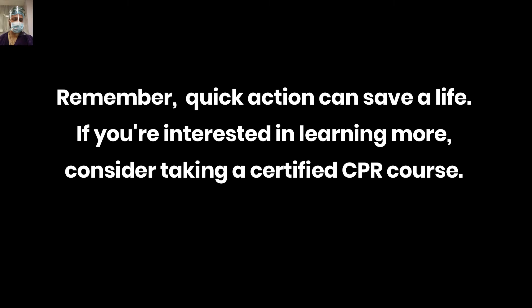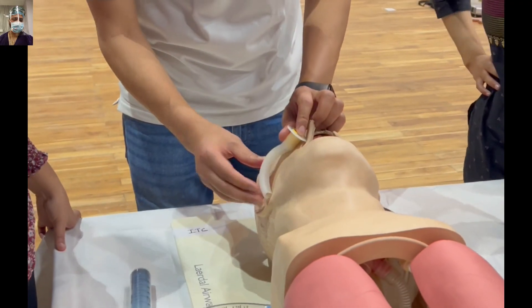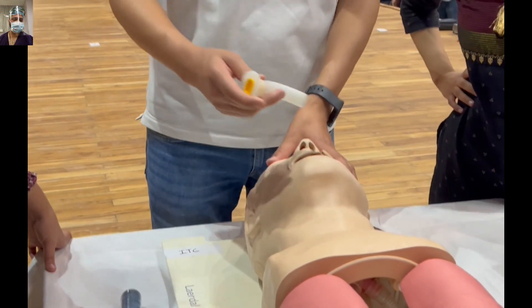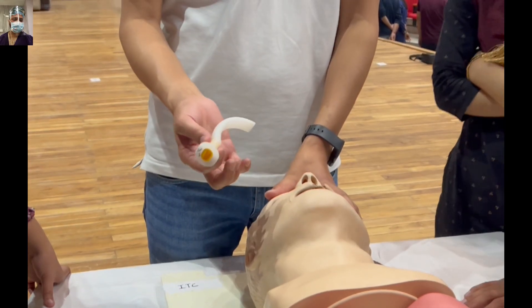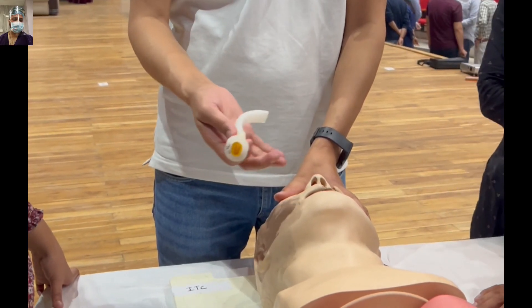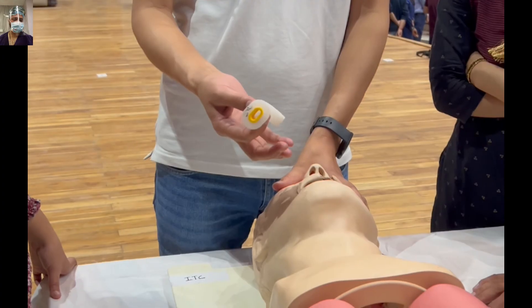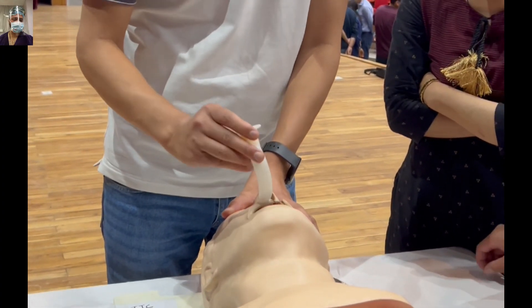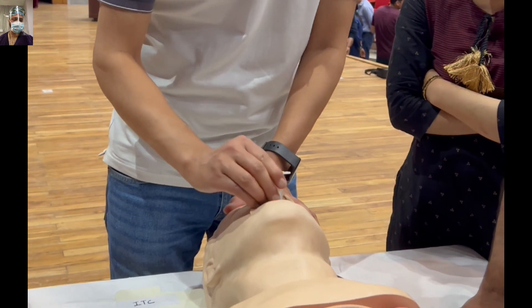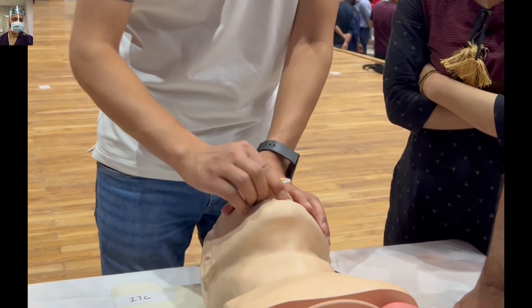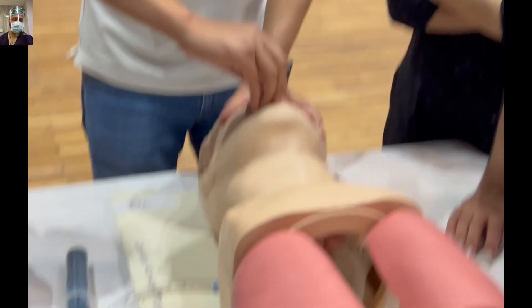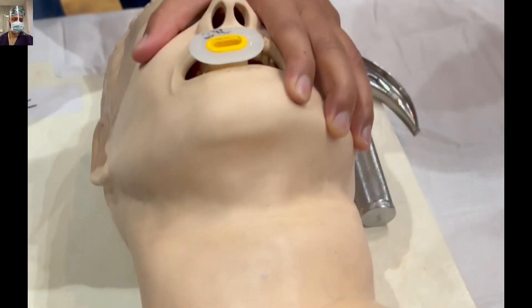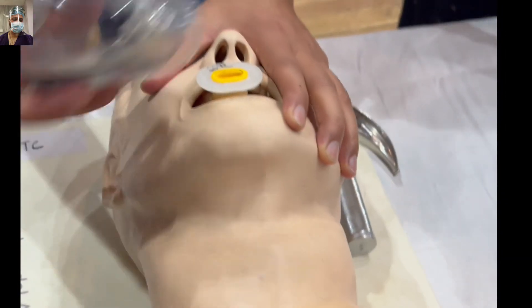Now we will run the whole sequence in a continuous video. First, measure the distance to assess the correct size of the Guedel's Airway — it should reach from the corner of the mouth to the tip of the ear lobule. Then, with the tip of the Guedel's Airway pointing toward you as you stand at the head end, insert it, rotate it 180 degrees, secure it, and start ventilating the patient.